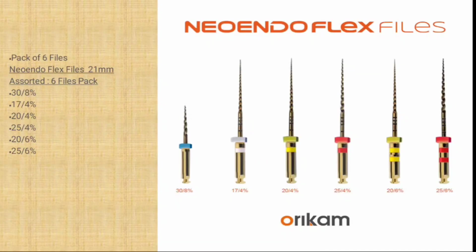So if we go and buy a NEOENDO flex files packet, what comes in that packet is a pack of 6 files. In NEOENDO flex files you will get an assorted pack of 6 files, in which the first is 30 by 8% taper, then 17 by 4% taper, then 20 4% taper, 25 4% taper, 20 6% taper, and 25 6% taper.